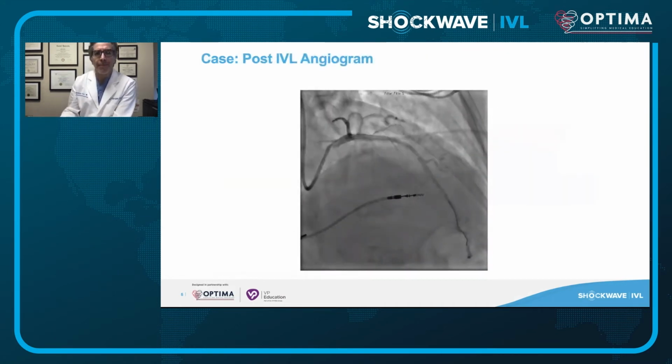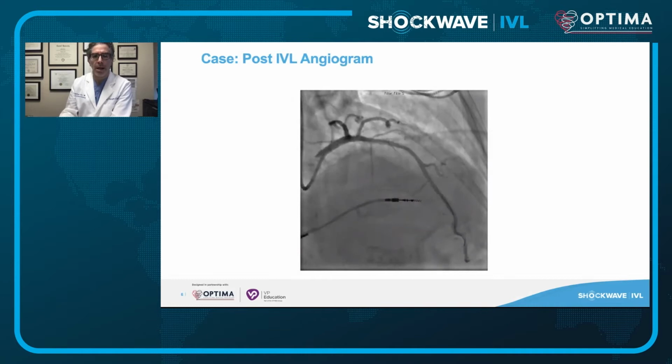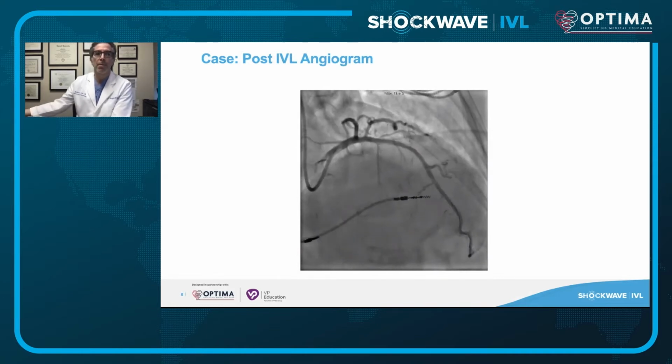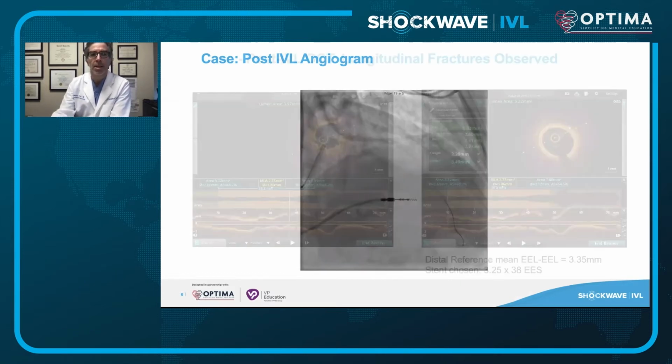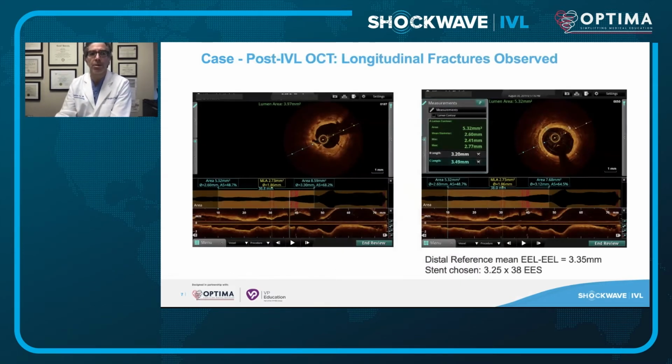This is the angiogram after IVL. A nice result with it. Look at that, a balloon at only really at maximum 6 atmospheres in that terrible calcification. I do a post-IVL OCT. Here you see very nicely the longitudinal fractures of the IVL catheter.